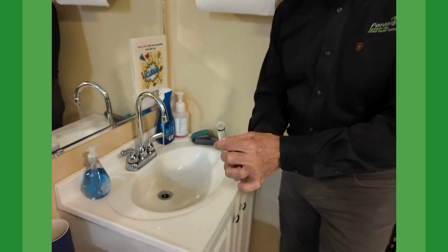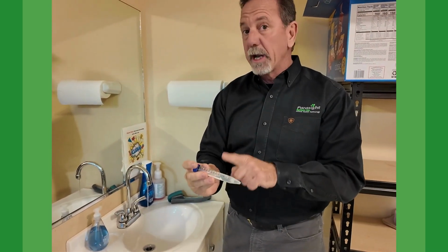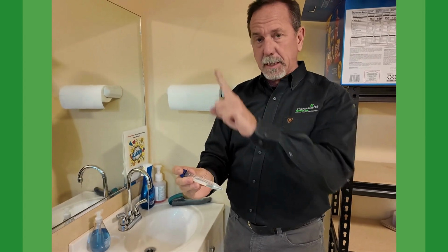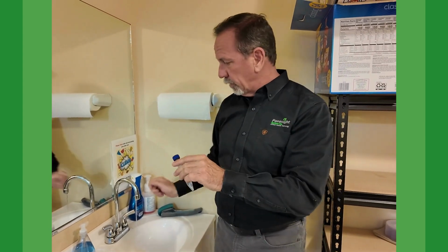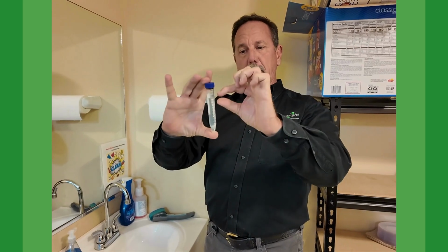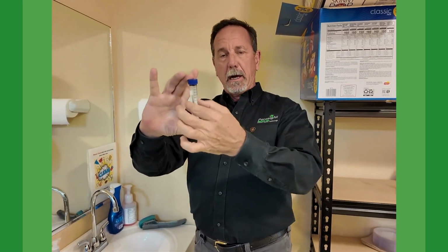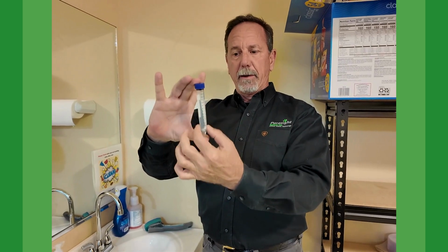And then once we've done that, we're going to put the cap on, and then we're going to mix that. So this is just regular water this time. It's not the colored Fecasol that you'd normally get, but now we're just going to mix that. And what you'll see almost immediately is the fats go to the top part, and then the rest will look grayish with regular fecal matter in it.